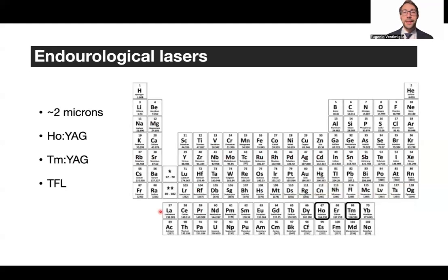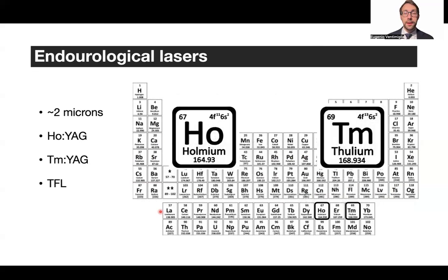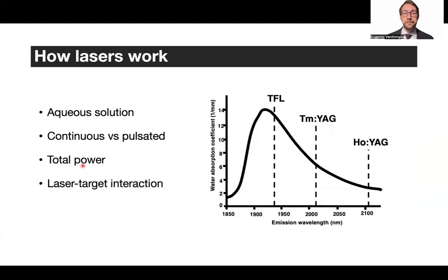Thinking of endourological lasers, we have to consider that they are mostly based on these two elements, holmium and thulium. The lasers we know very well, it's of course holmium YAG, but still thulium YAG is also very utilized. And the most recently introduced is thulium fiber laser. We're going to see now wide differences in terms of application for them.